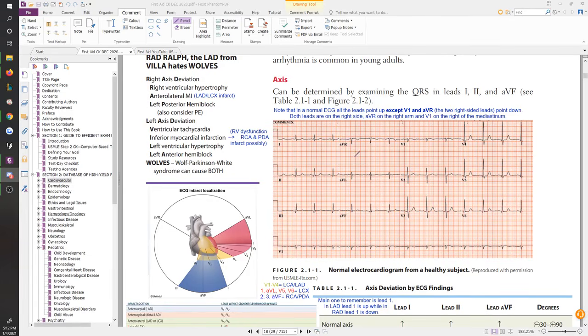Alright, so let's get into this. So we have this blank ECG. What are things you're going to look at, right? So these are some of the things we're going to be talking about right now as we go on. As soon as you get an ECG, the first thing you should do, assuming that it's in standard format, is divide it in half. You want to cut it in half right here, right? Such that you have your 1, 2, 3, AVR, AVL, AVF on the left half, and then you have your V guys, V1 all the way to V6 on the right half.